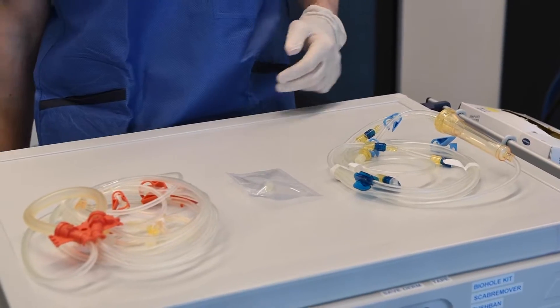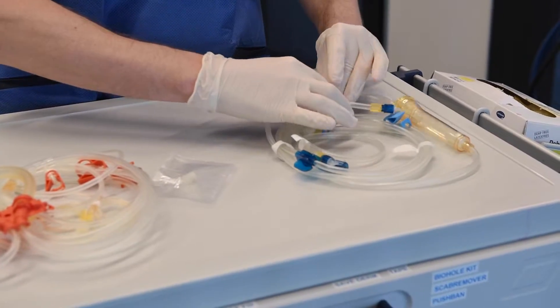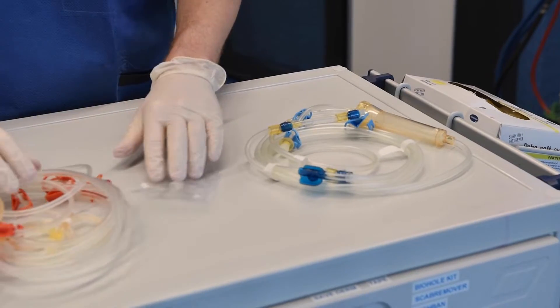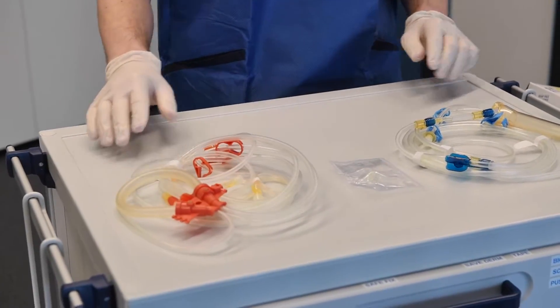The package contains an arterial line, a venous line and a sterile cap. Check the bloodlines to make sure they are ready for use, and check the connectors and caps to make sure they are not loose. This bloodline can be used for priming with normal saline or with DIF, the dialysate infusion function.